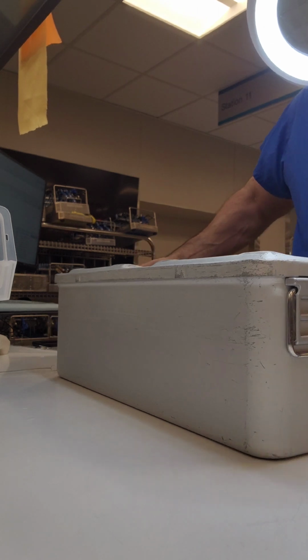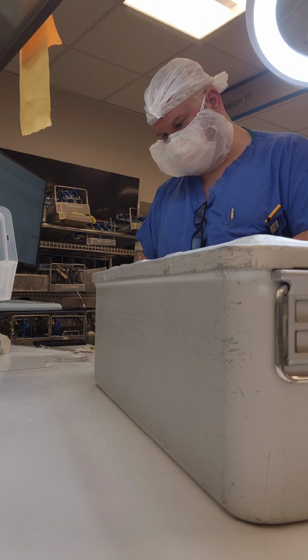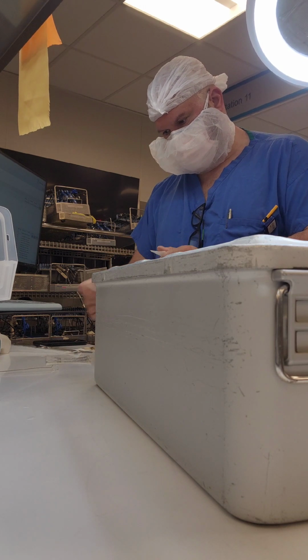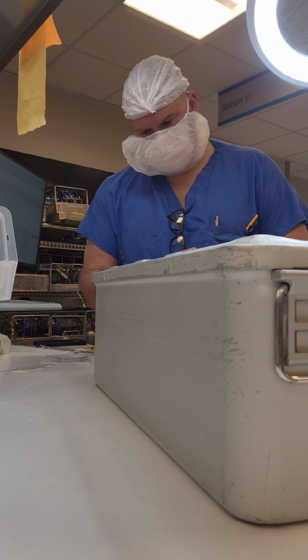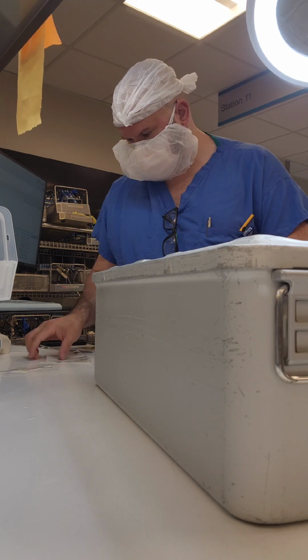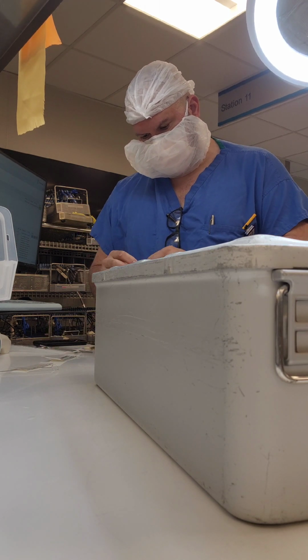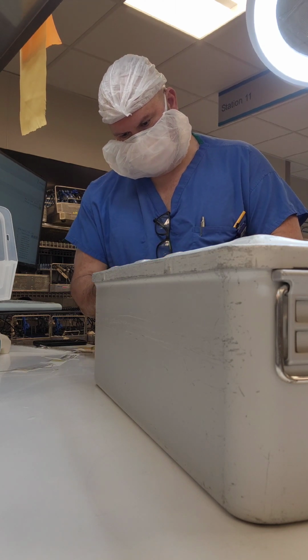Okay, I also need to place my tags on there. So I had a missing instrument tag and the identification of the actual basket, one on each side. One, two, the missing instrument and the basket identifier on the one side and then the other. So this is how we do that here.